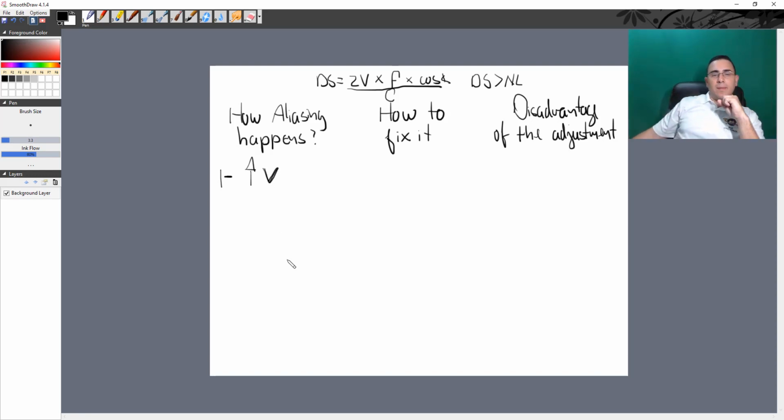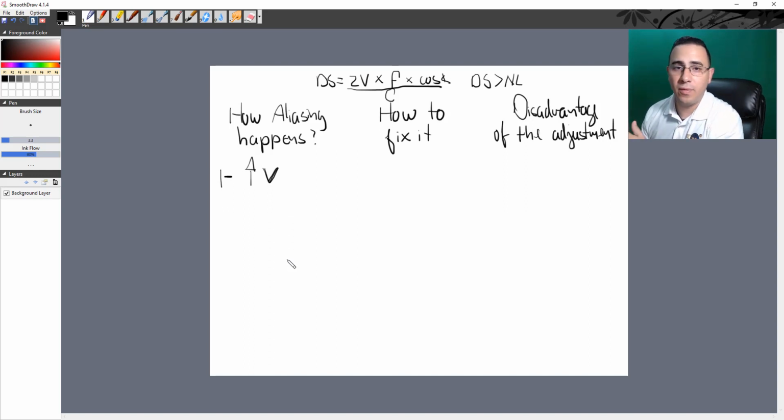How to fix it? Remember, flow velocity belongs to the patient. So we cannot tell the patient, "Can you make the flow in the internal carotid a little bit slower? I cannot measure my wave." Or, "Can you make the flow in your mitral valve a little bit slower because I cannot measure this wave?" No, you cannot do that.